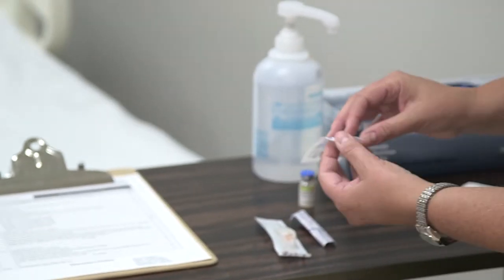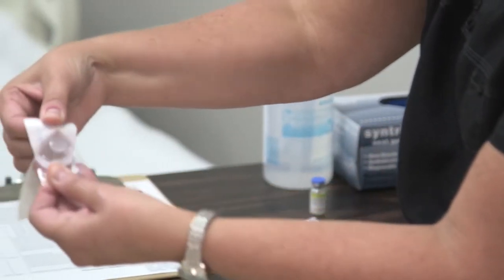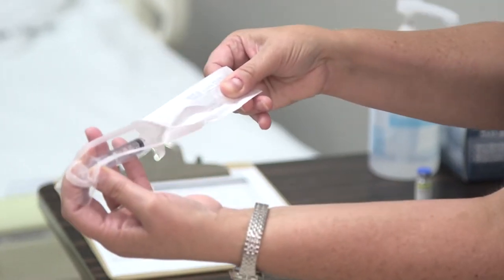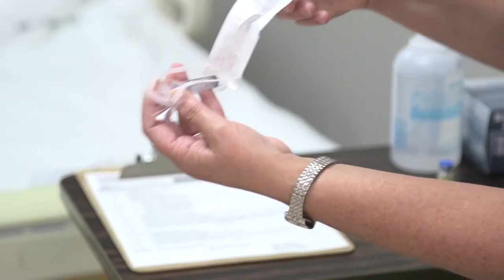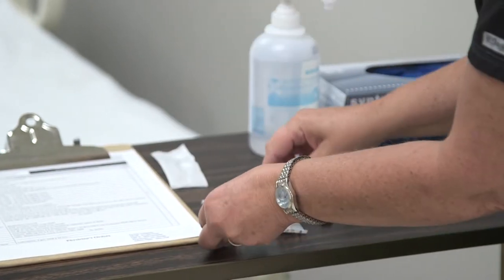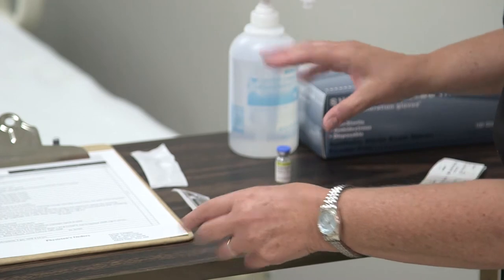All right, so this is my syringe, and you want to make sure that you open it and keep it sterile. So basically all you have to do is just open it. Don't really touch anything there yet. You can touch the plunger, but you don't want to touch anything else.